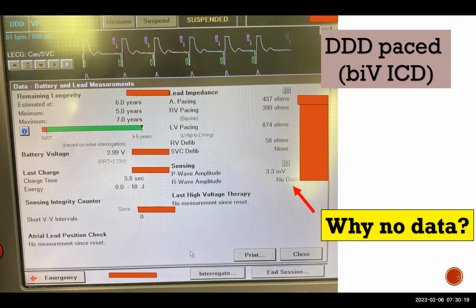Now, most people with heart block do have an escape rhythm, and you can check the R wave. But if we dropped it down in a patient like this and we still had no R wave, that's important information for when we are doing a generator change, for how long we want to leave the device unplugged from the pacemaker. In the old days, when we used to use a lot of unipolar pacemaker leads, which require that the can be part of the pacing bipole, as soon as you take the device out of the pocket, the patient would lose capture because the circuit would be broken.